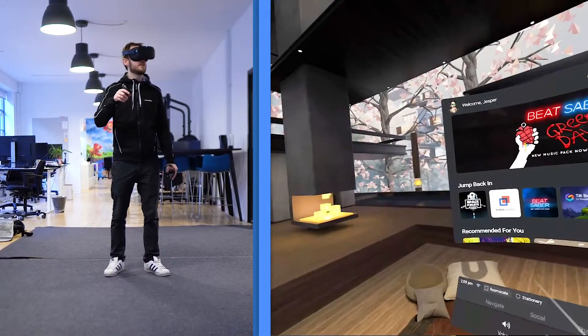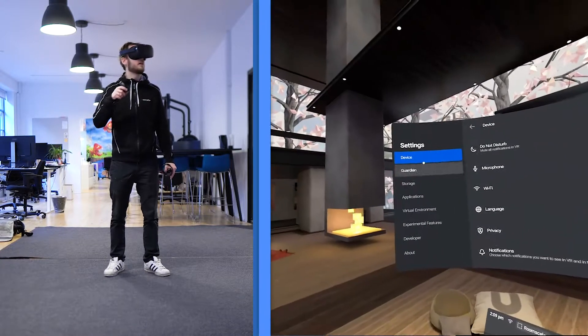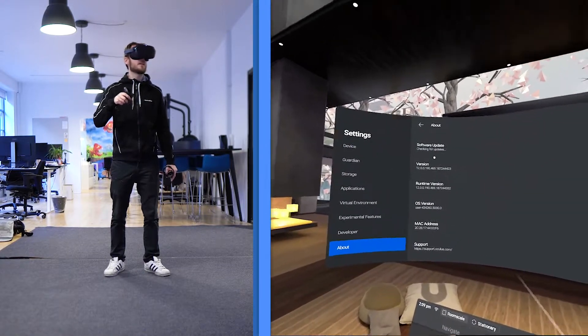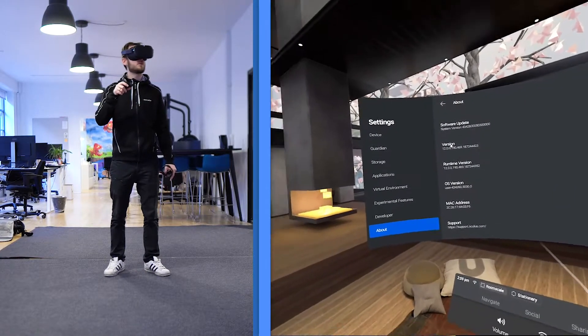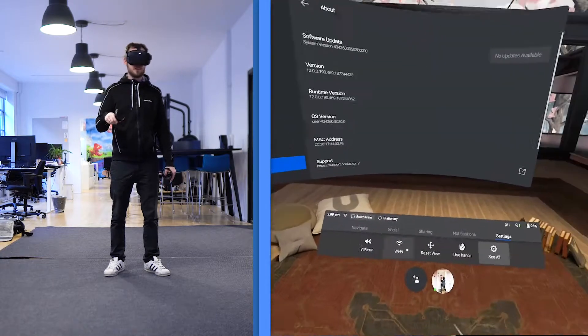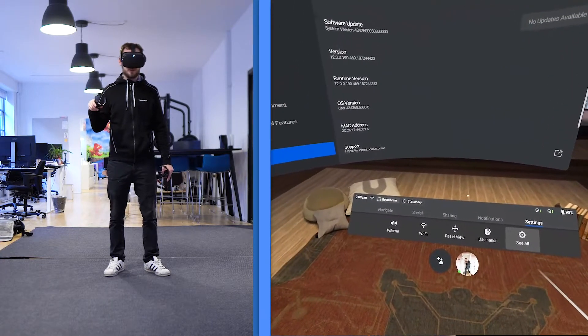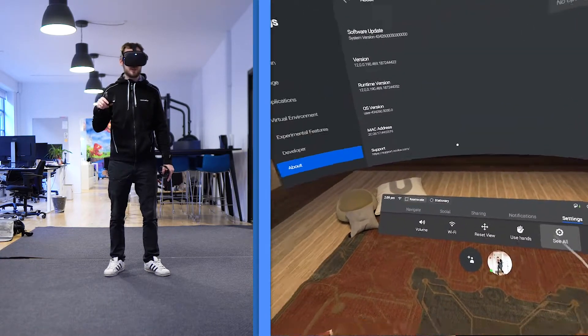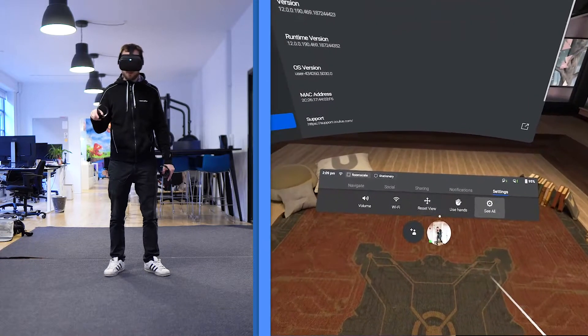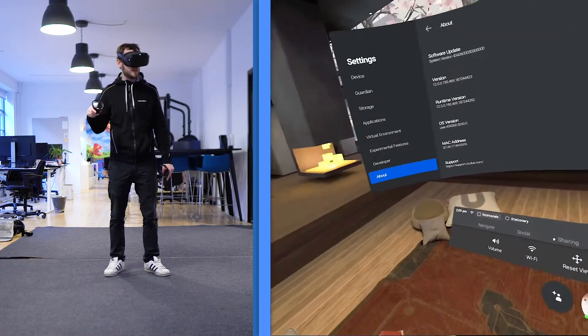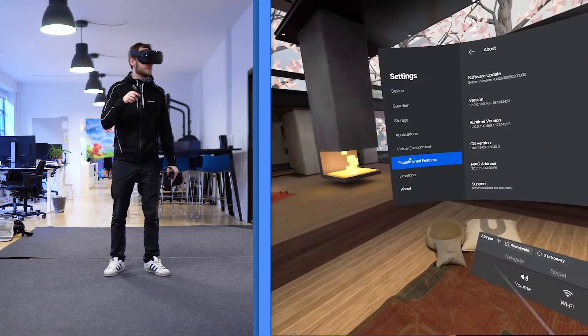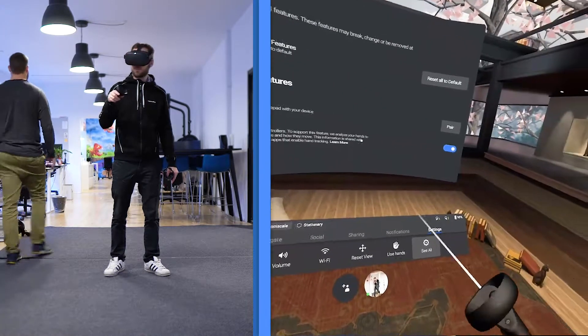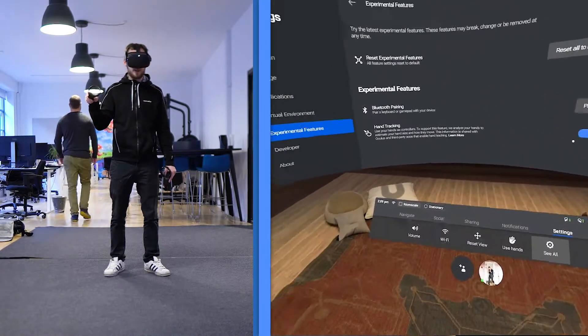First off, you need to get the software update, which is 12.0, and you need to enable developer mode inside the app on your phone or on your iPad device. And then you go into experimental features here and then you enable hand tracking.